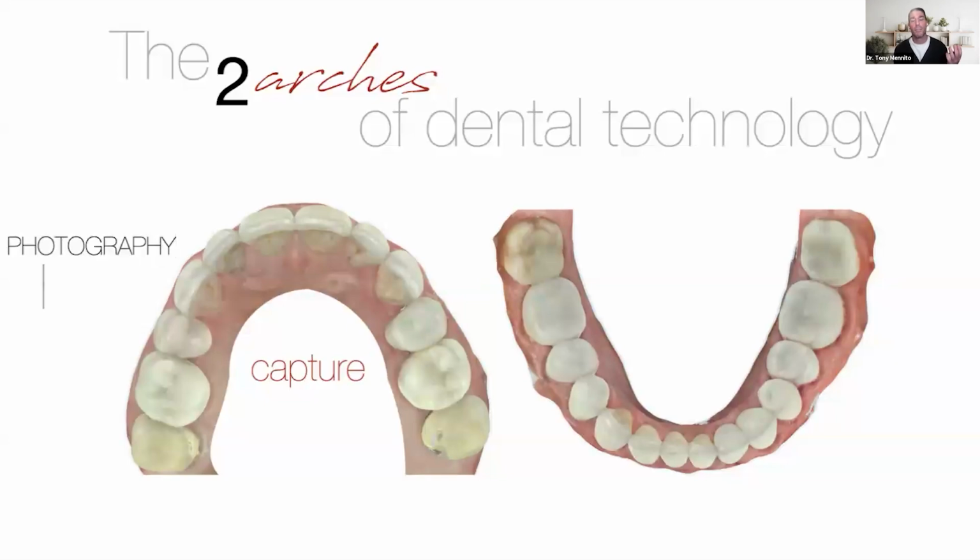That includes things like photography, both intraoral and extraoral, CBCT, cone beam CT, which is essentially a 3D X-ray, and then intraoral scanning. All these things fit within the capture arch, along with 2D radiology and face scanning. If you're really into technology, face scanning is still kind of a niche technology, but that is part of the capture arch as well.